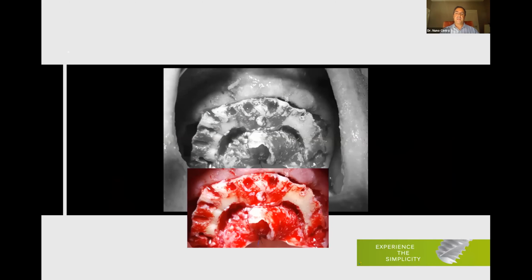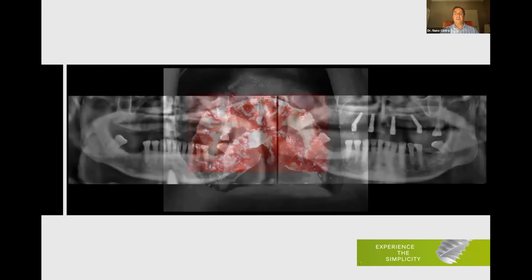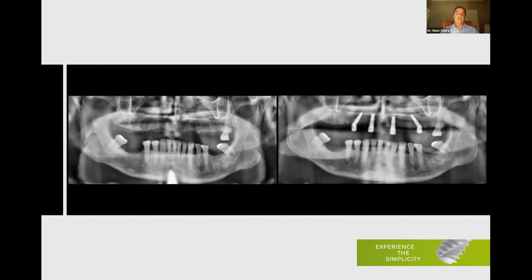As I told you before, if I have full bone volume, I go for 6. Look at this case, a huge crest, a lot of bone available. This is a gentleman in his 40s, big guy, big masseters, a lot of torque, a lot of force. And what happened? It was not an all-on-6, it was an all-on-4. So in my opinion, this is wrong. This patient, with all this amount of bone, and considering his physical fitness and his age and the anatomy of this crest, this should have been an all-on-6, not an all-on-4.